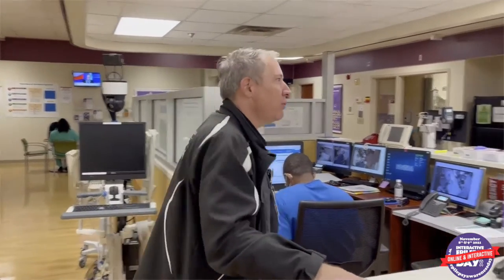Okay, this is an emergency. We understand that when patients come here, they're very vulnerable because we titrate down their medication to see more of those events happen so they can be better diagnosed and treated in the future. Let's show you a patient's room.